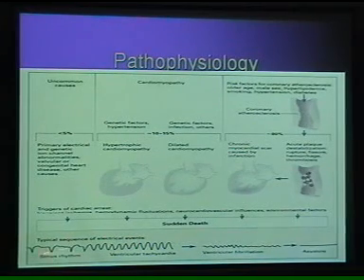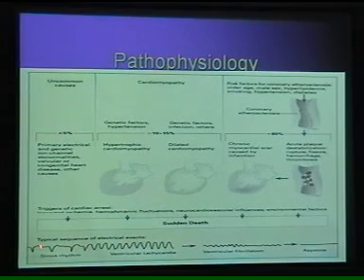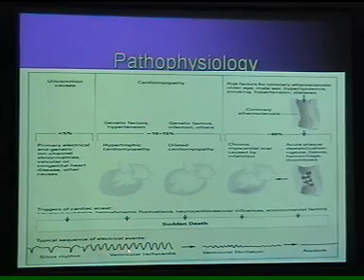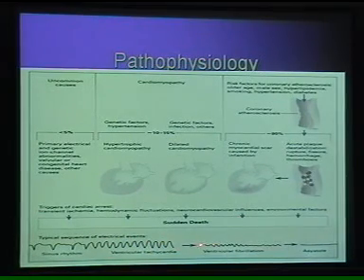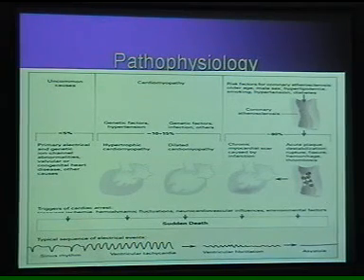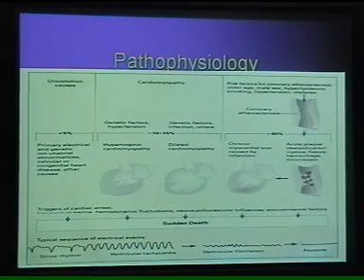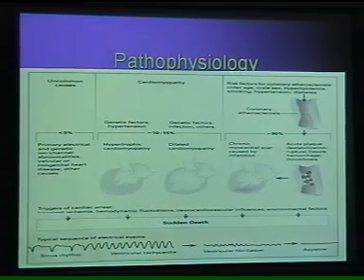Now this is the sequence of events that shows the normal sinus rhythm. It changes to ventricular tachycardia and eventually ventricular fibrillation. Now ventricular fibrillation means technically, clinically, the death of the person unless it is reverted within 3 minutes. Next one.